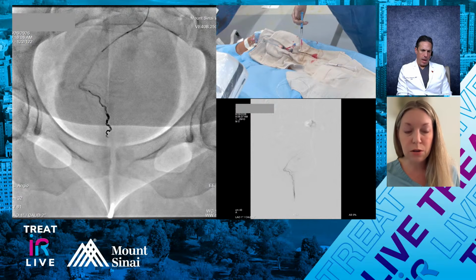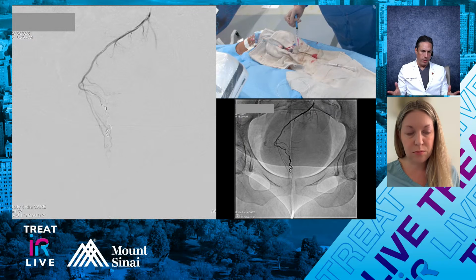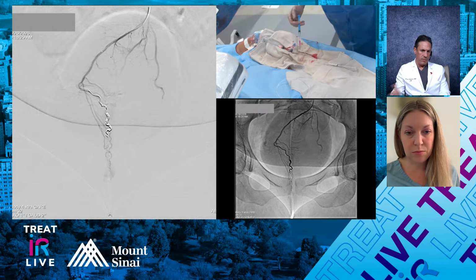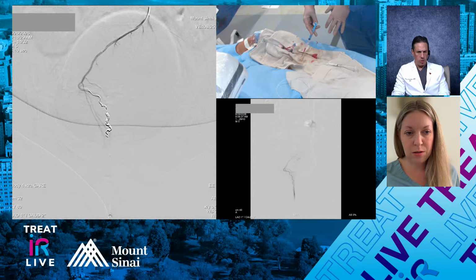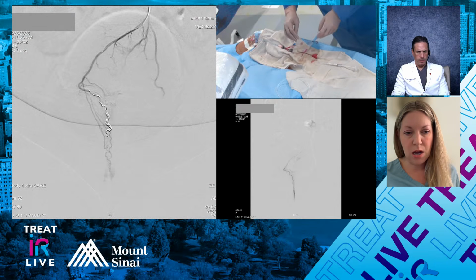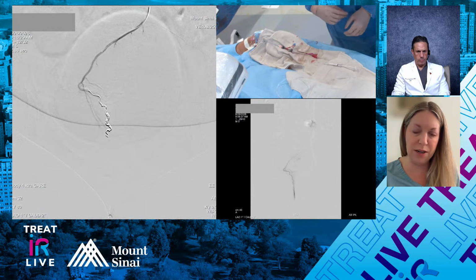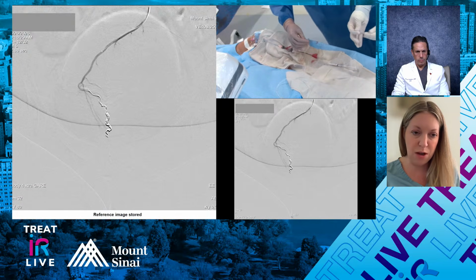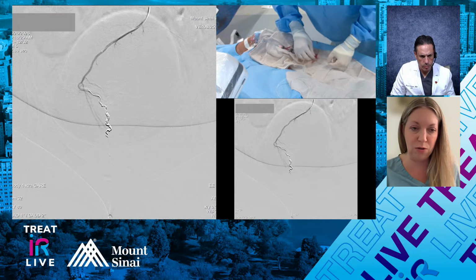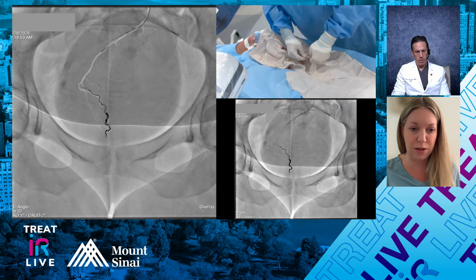So how does everybody decide when you're done? Are we looking for complete devascularization of the area, or are we going to leave some vessels open to allow perfusion of that area? What's the end point here? I would say we're really looking to take away any ones that are vertical and perfusing that area near the pubic symphysis where we're seeing CCR. If there's a significant blush associated with that, and it's very vertical, then I want to take care of it. Otherwise, I'm not trying to devascularize the whole area, but really those vertical areas that lead to blush.